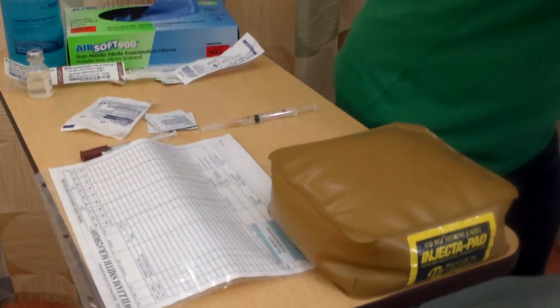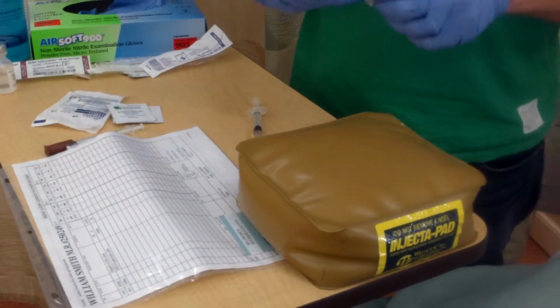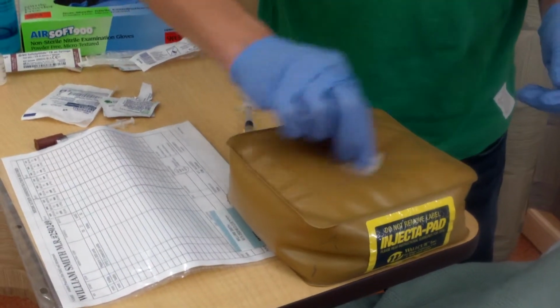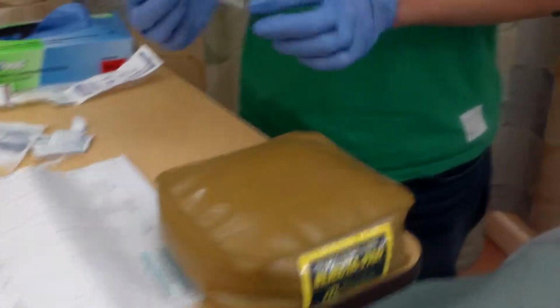Provide for privacy for my patient. So with that, I have my medication. Once again, I need to clean that. Start from the center and then work in a circle outward. I will then take the needle. And now this, you want to go to a 45 to 90 degree.